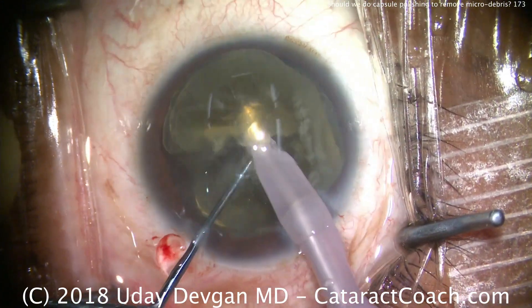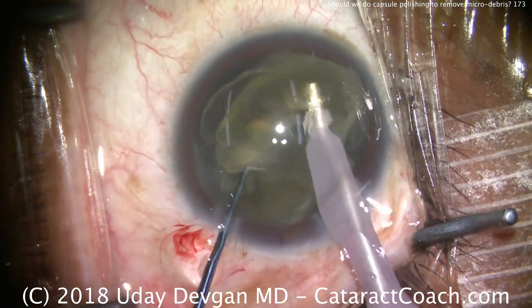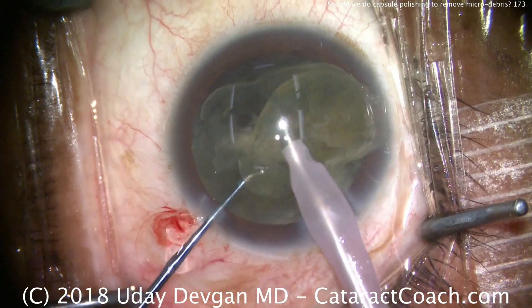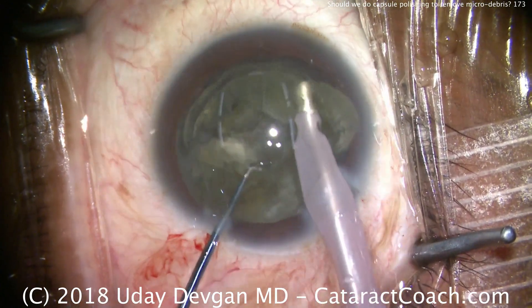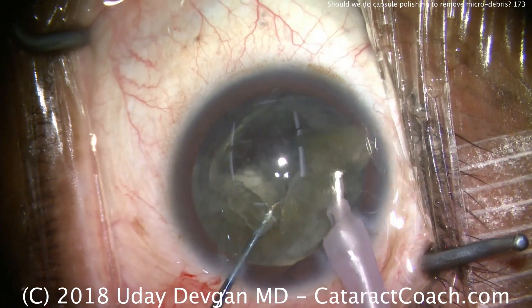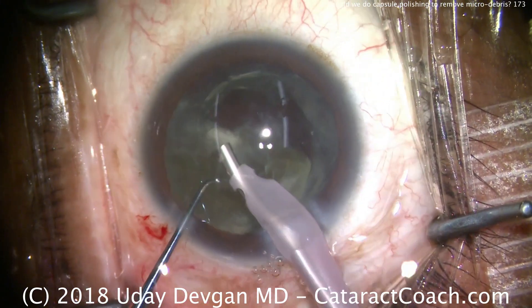The chopper goes on the periphery and we cut in half, so we have two halves — each one can be emulsified very rapidly. In a case like this where visualization is poor, I definitely like to get the lens out of the capsular bag. I know I'm then operating away from the posterior capsule, in a safer zone.